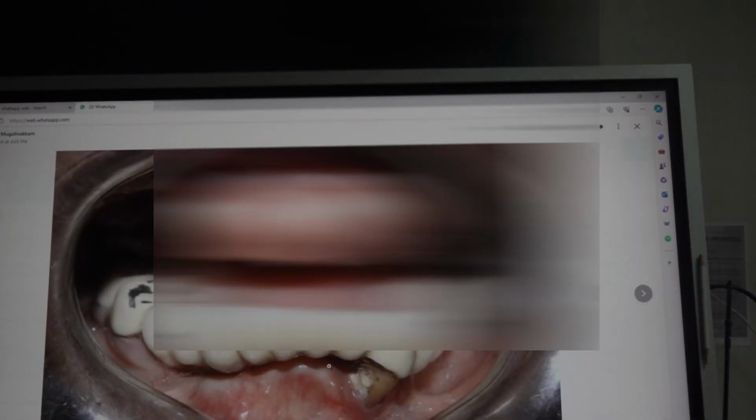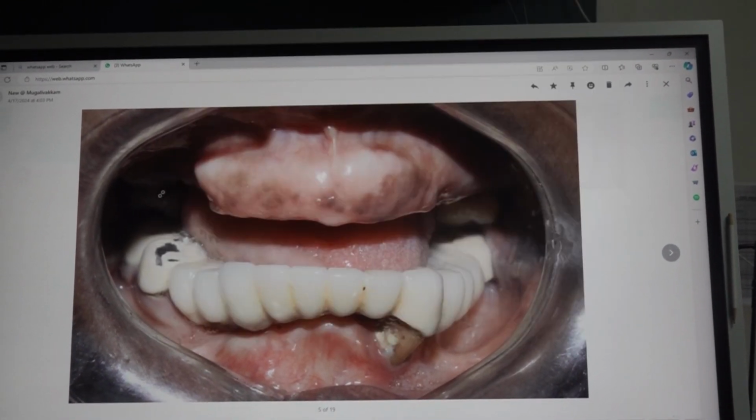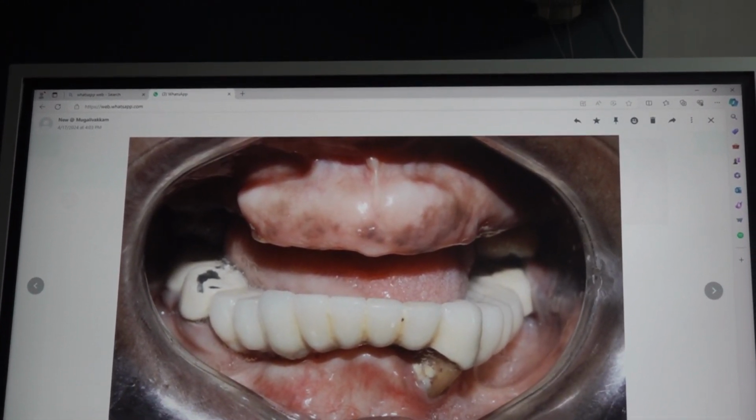Without denture, what is that? See the difference, no? This is without denture, right? But here the lips are competent. So post-surgically she will become like this one. And this lower lip may go a little bit inside because we will be solving this proclination, right? The main problem is this area, right? If they have done an alveoloplasty and given a complete denture, aesthetically it will be satisfactory.